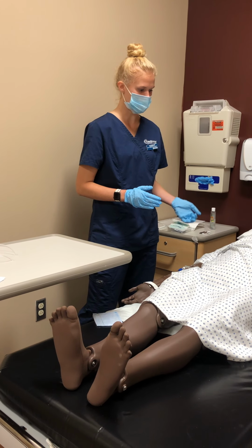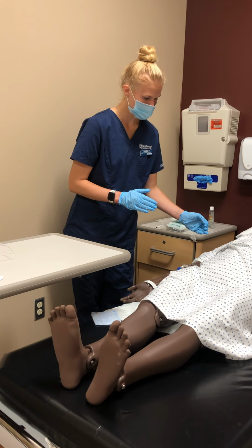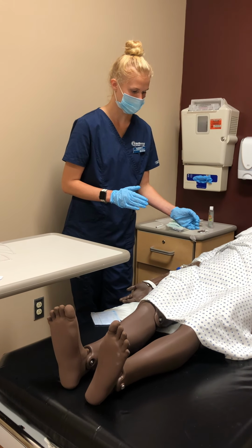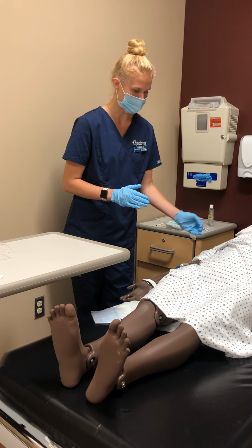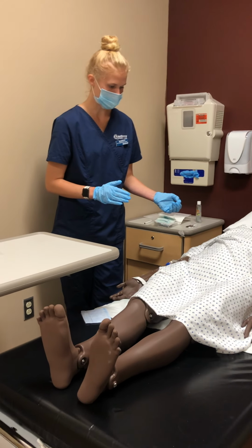Before I do the drainage, I actually want to check the arm circumference. I'd go 6 inches above the IV site and measure that arm circumference.